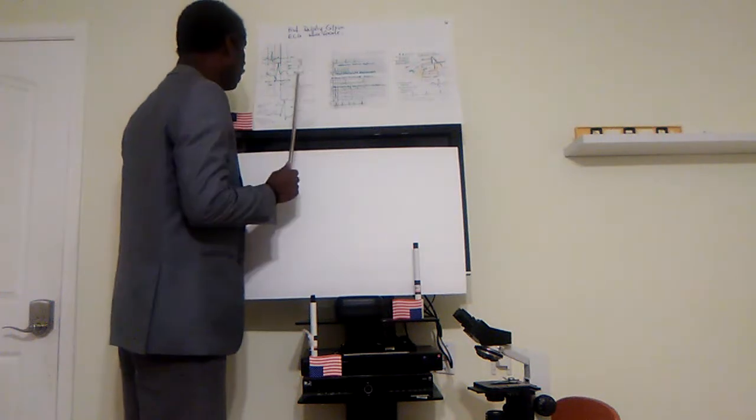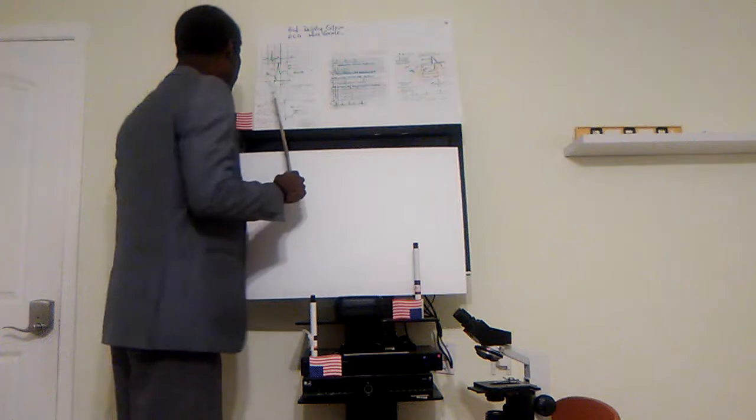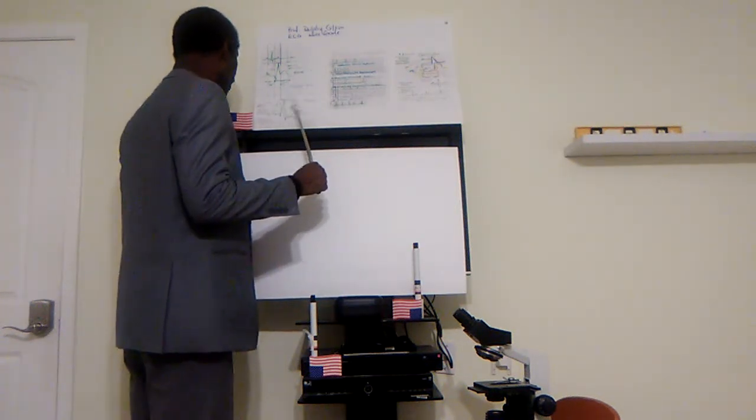So that's an ST elevation myocardial infarction representation, called STEMI. And down at the bottom one here, it's just the same normal representation for a normal electrocardiogram.